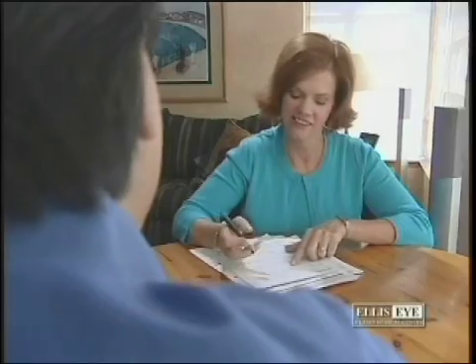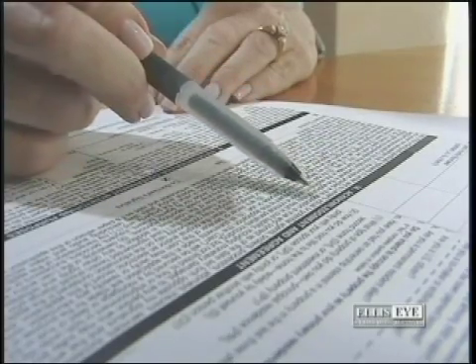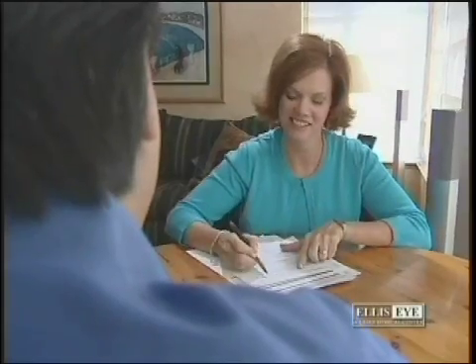wear glasses for anything. We can now, by the way, do monovision, where we set one eye for distance and we make one eye slightly nearsighted. So if a person is very nearsighted, we would leave a little bit of residual nearsightedness in the reading eye so that they can read up close and use the dominant eye for distance. That's called monovision. If people are farsighted, I think it'll be possible to correct one eye for distance and similarly make the other eye slightly nearsighted so that they can read.